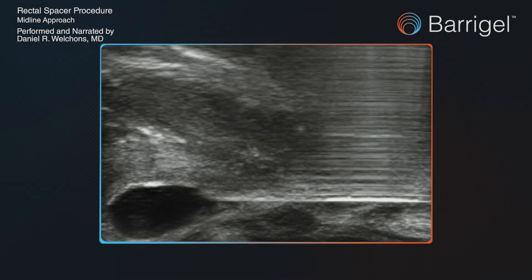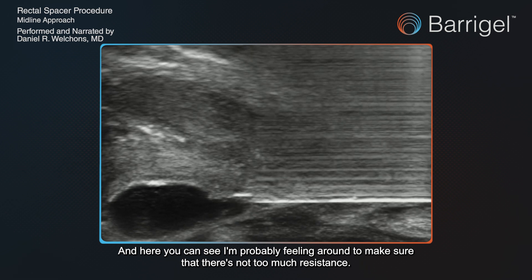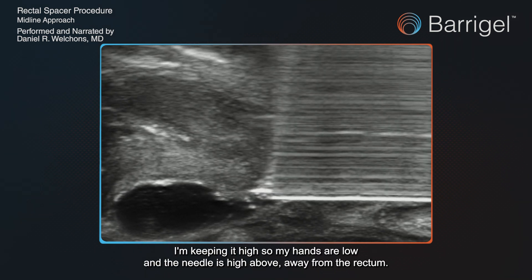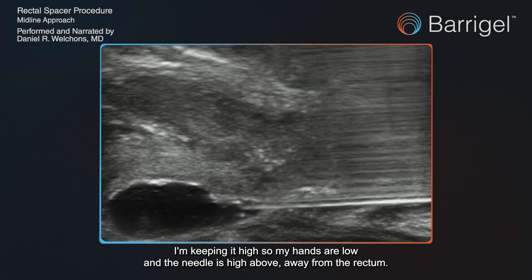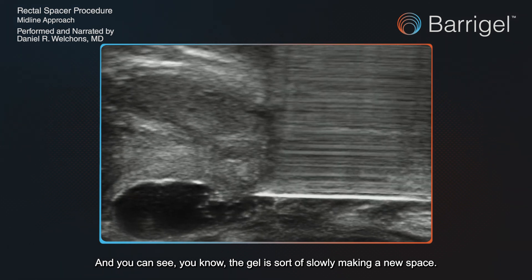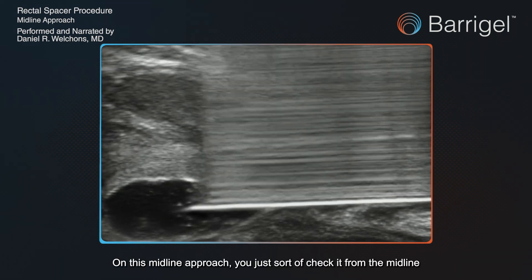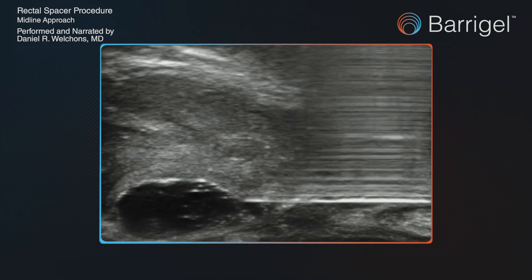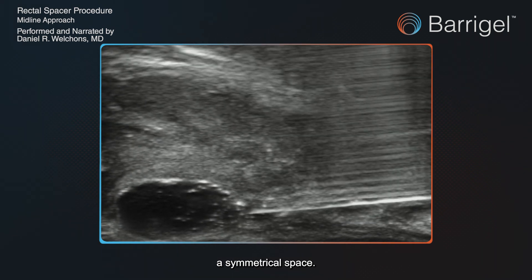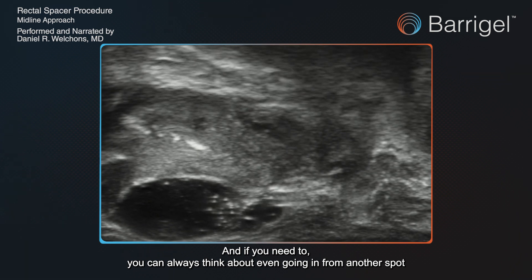I tend to switch between the two views a lot, just to make sure I'm in a safe area and putting the gel in the best spot with the best symmetry. Here I'm feeling around to make sure there's not too much resistance. I'm pulling back a little on the needle, keeping it high — so my hands are low and the needle is up away from the rectum — and just injecting slowly. You can see the gel slowly making a new space. Some of it's leaking back to the base, which sometimes happens with scarring. I check from the midline as I inject, then go left and right in the sagittal view to confirm a symmetrical space.